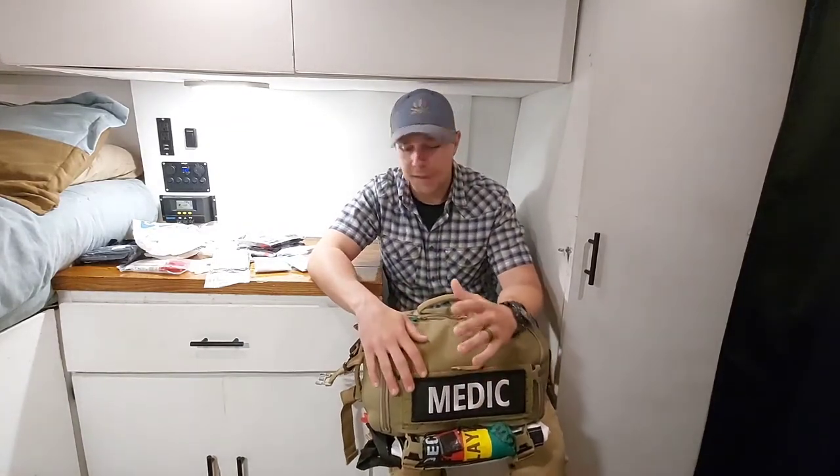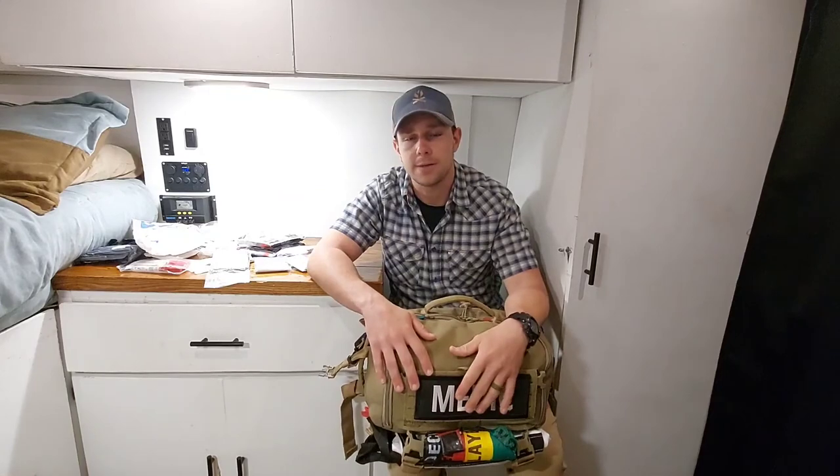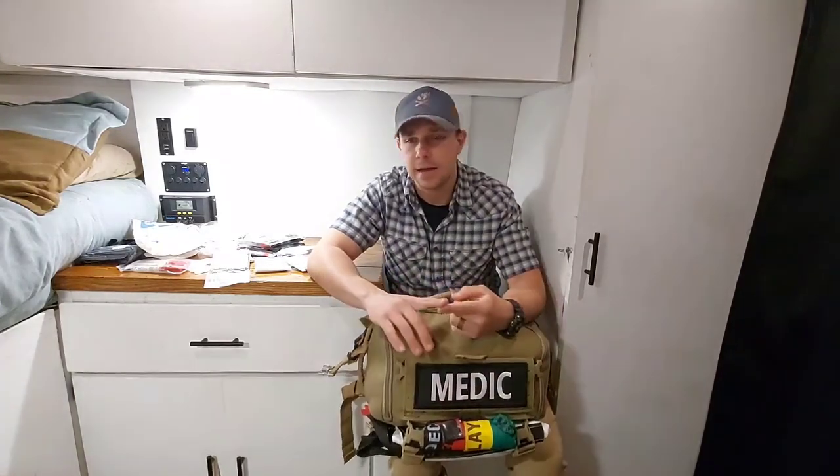Well that about wraps it up. I highly recommend you guys get out there and learn all you can about trauma pre-hospital medicine. A lot of this equipment you can get fairly cheap. Go to your local army surplus shop and find it for about a quarter of the price. Yes, a lot of it's expired, but in the long run a lot of the hemostatic agents, the tourniquets, chest seals, etc. are all still going to work. So get out there, buy yourself a bag, buy some equipment, get some training, and save lives. We'll catch y'all later.